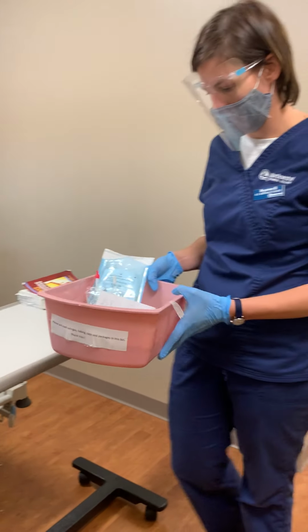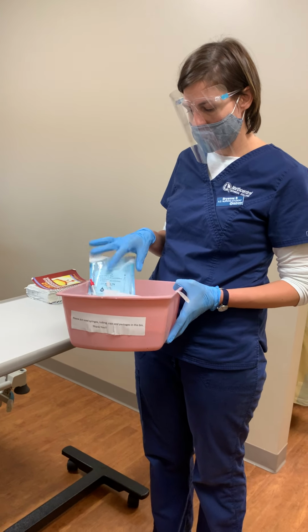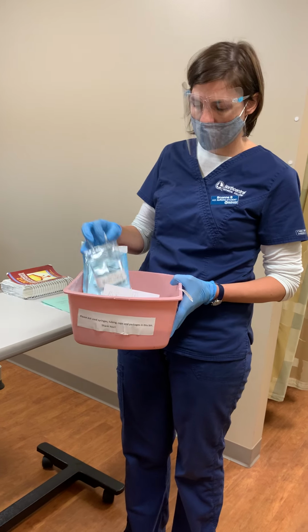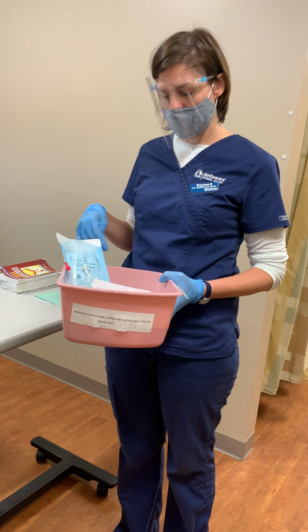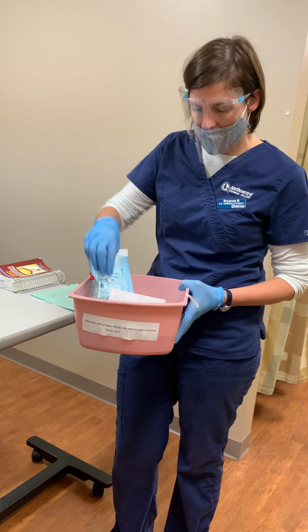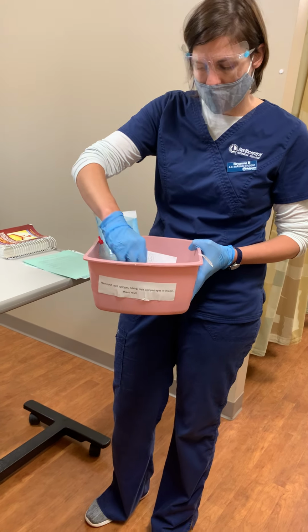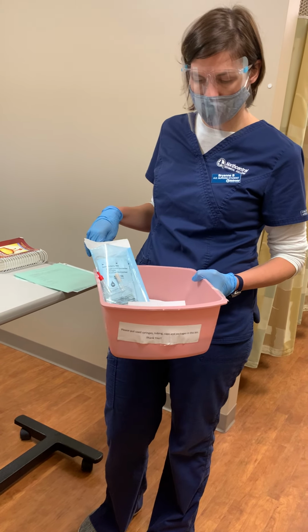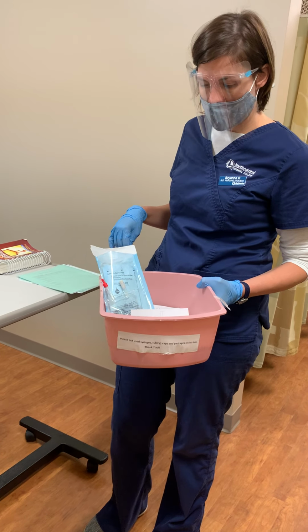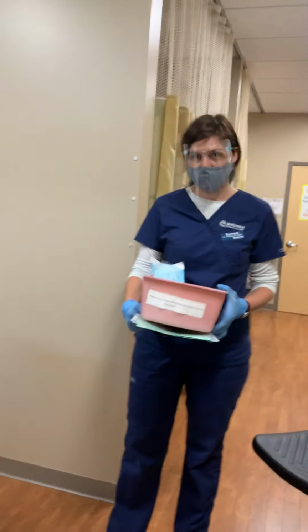So I've gathered my supplies for this procedure, or these procedures. I have my secondary tubing and my potassium chloride secondary bag. I also have my change kit for my central line dressing, and I have my flushes, which I've made sure the air bubbles are out of already, and my morphine, as well as my necessary syringe for the patient room. I'm now going to enter the patient room to provide patient care.